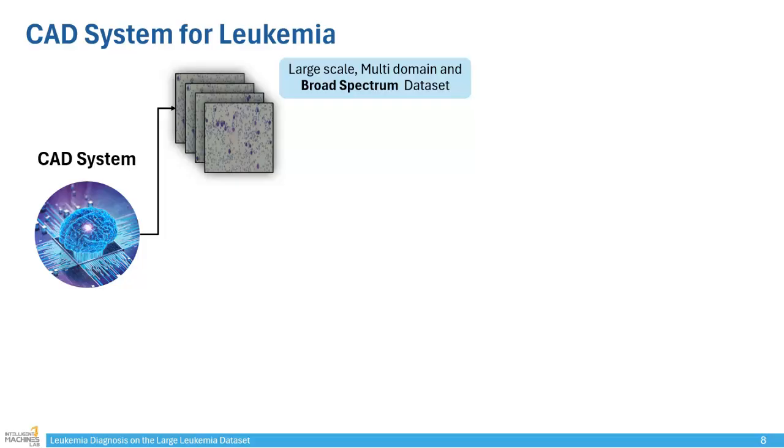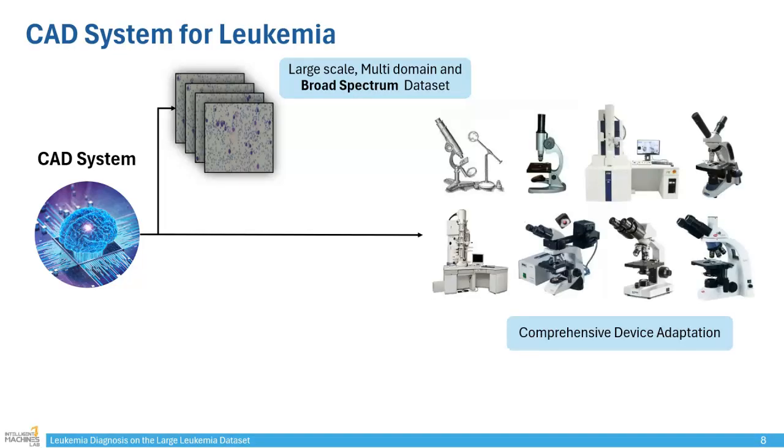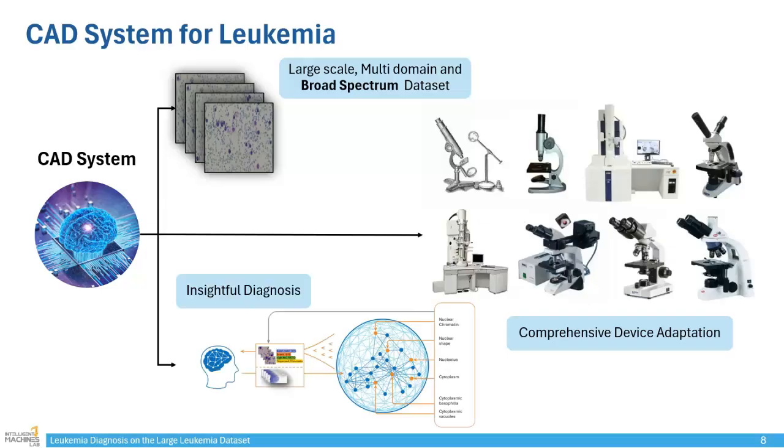The performance of the CAD system is directly dependent on a large and comprehensive dataset. Secondly, the implementation of the CAD system must be adaptable to various settings. And most importantly, to gain the trust of medical professionals, the diagnosis must be insightful.